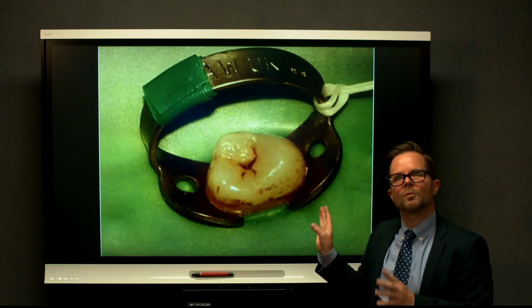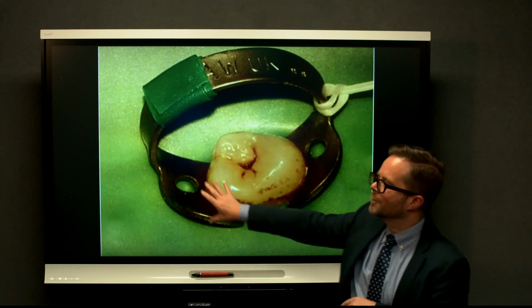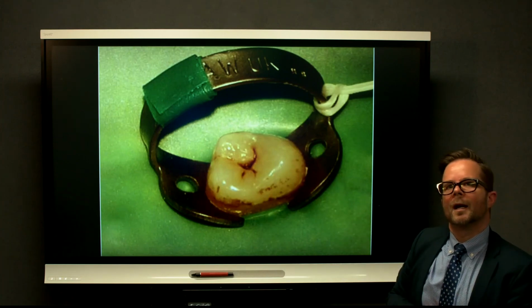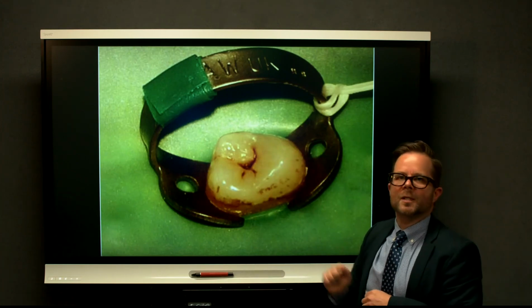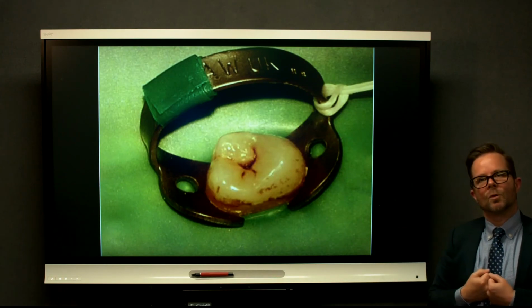And here is a tooth with a rubber dam in place. Okay, so it's got a rubber coat over it, which is held in place by this clamp. Resin composites require this, otherwise the moisture present in the mouth will cause them to fail.